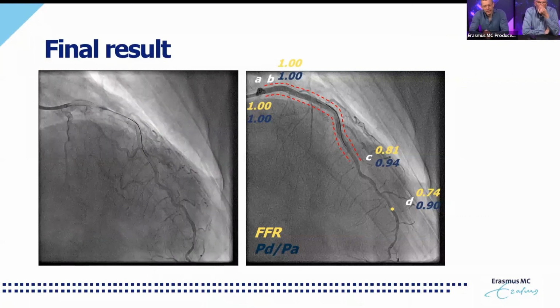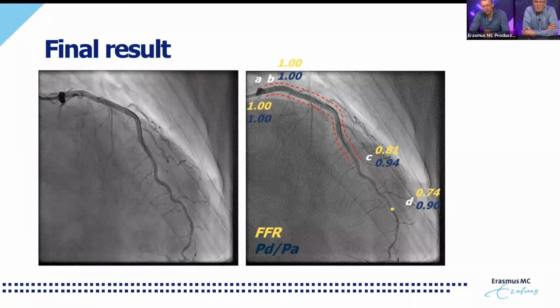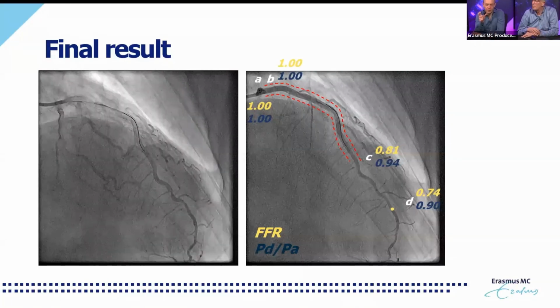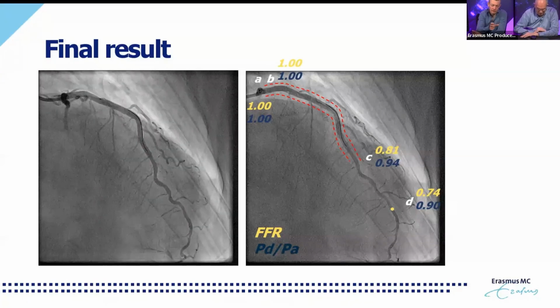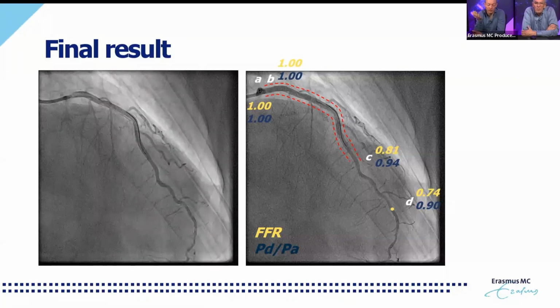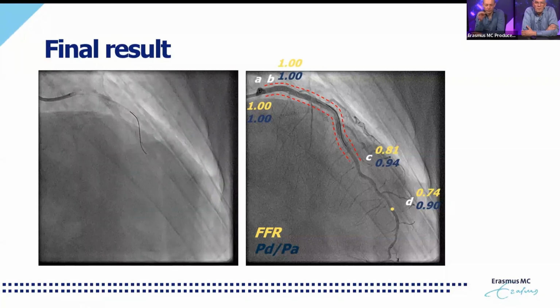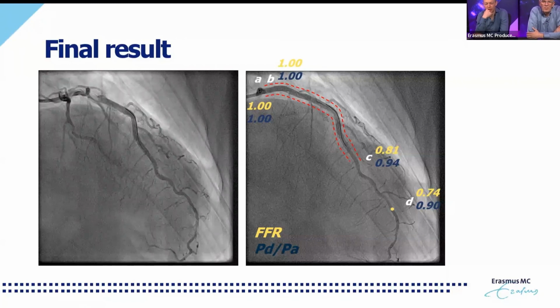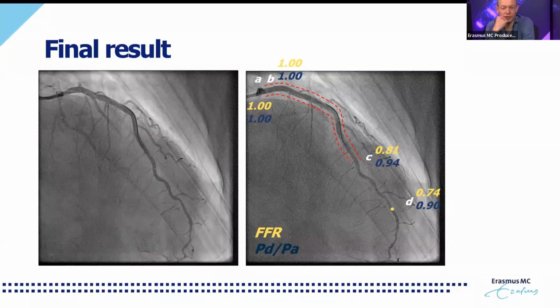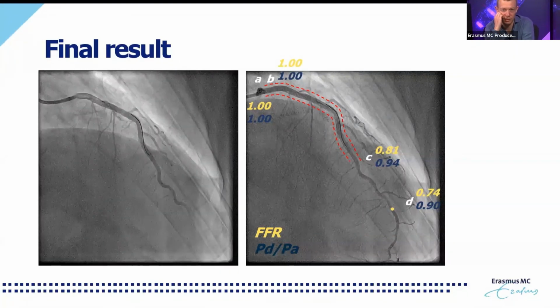accepted officially. But what we learned, and I think that is one of the critical parts we learned from the program we did with the ACIST technology, so from the FFR SEARCH registry, SEARCH IVUS, now FFR REACT, is that the correlation between pressure gradients based on physiology and focal disease as recognized by imaging is actually not so good. So we are currently validating the individual cutoffs that have been used, so let's say 0.05, 0.03, and so on, across the stent and proximal and distal to the stent, against the presence of focal residual disease as defined by IVUS, and found that there is a correlation, but it's a relatively weak correlation. So in our experience here, we really push for having a very low threshold of using intracoronary imaging in case the physiological result is suboptimal.